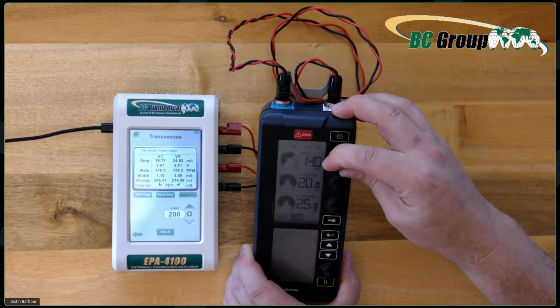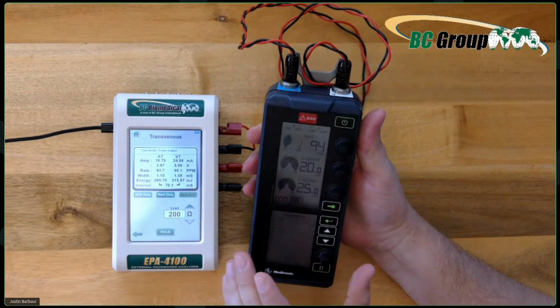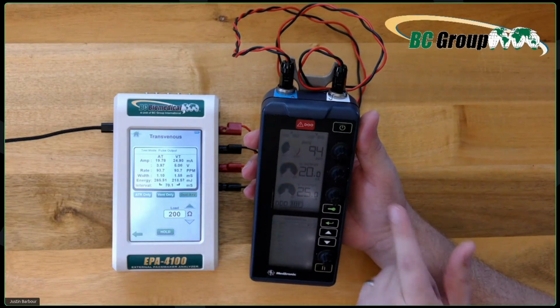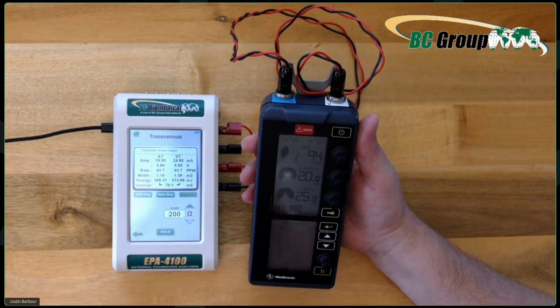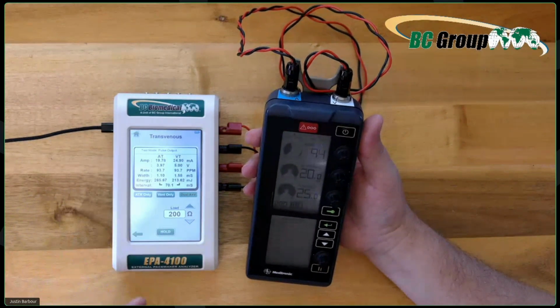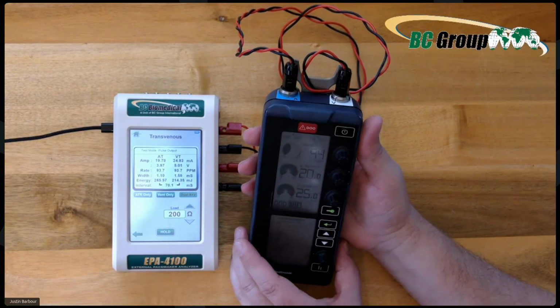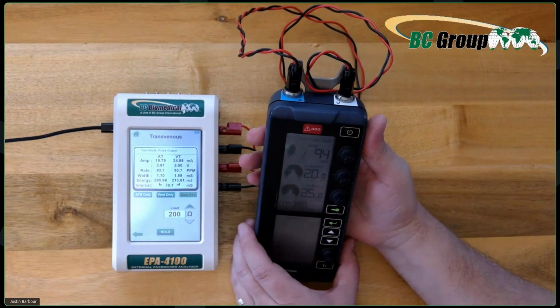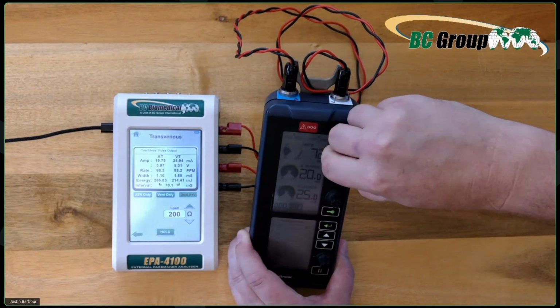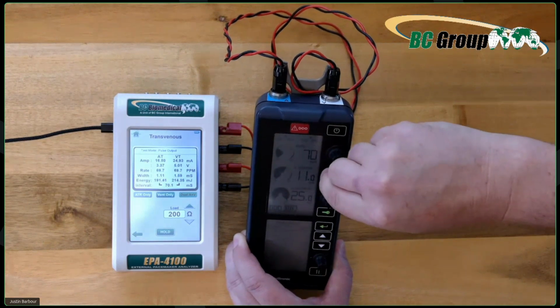Let's turn it down to something more reasonable. But that tests the full capacity of this guy right here because I had it absolutely maxed out on the pulses and on the amplitude. If it was going to fail very highly, it was going to fail right there, because your readings will start to track further and further from the standard as you're pushing it to its limits, because that's a lot of pulses. Let's take this guy down to a very paltry 70 ppm, and let's take it down to 10 milliamp.